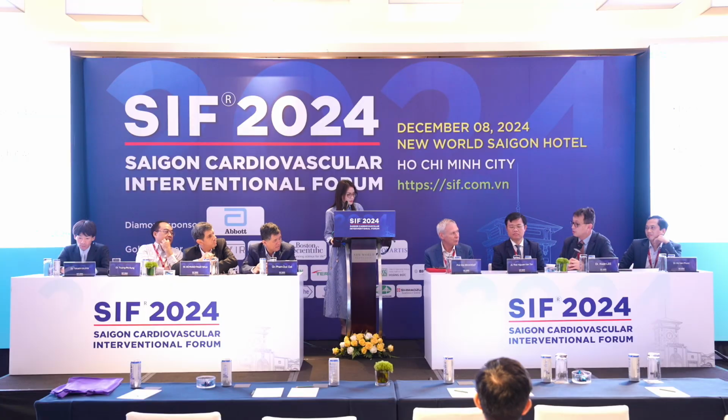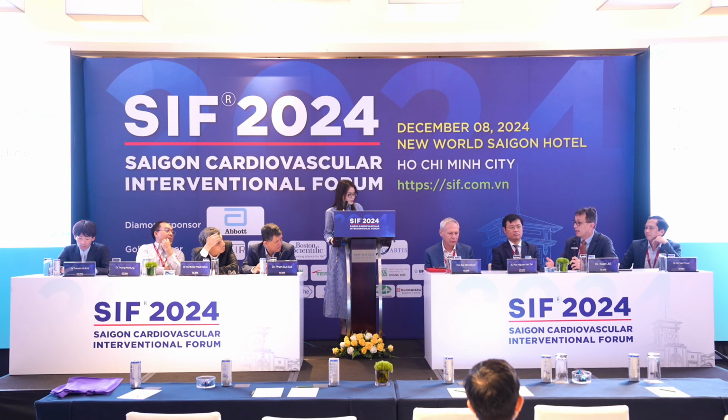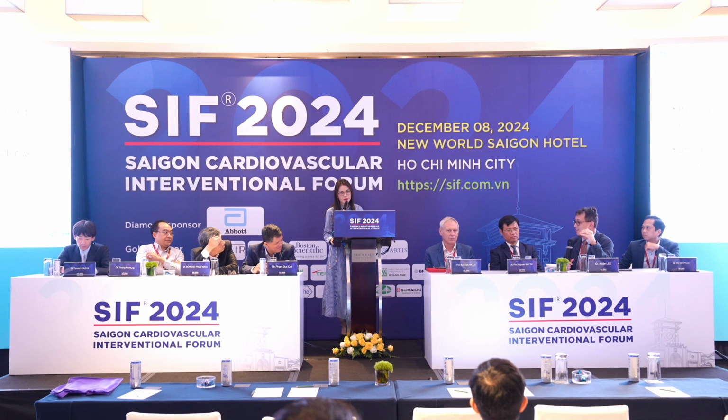But obviously, if you want to look at the data with these high SYNTAX score patients at that age, and then your second patient, I think you said the patient also had severe mitral regurgitation in the setting of low EF. Yes, it's the first time I have used two guiding catheters, and I will protect the OM because we have two guiding catheters. We have one guiding for two wires, okay. But I just use it when I rescue the OM.